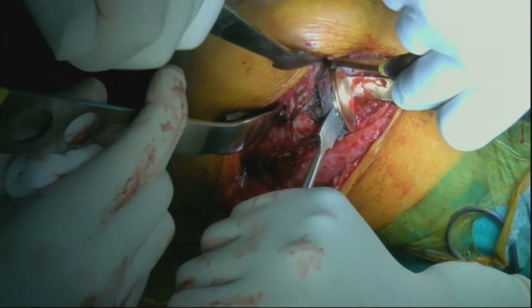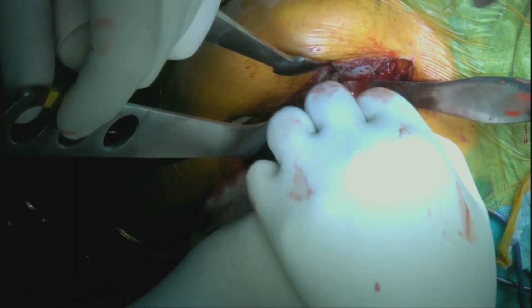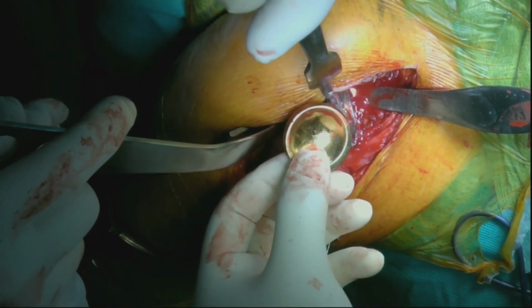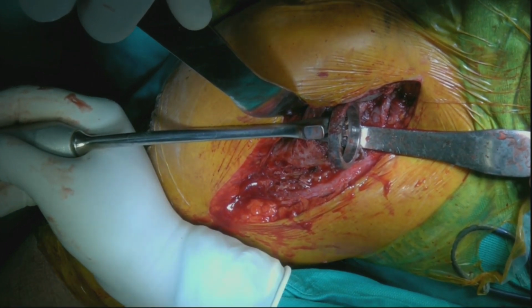And I have different videos of the surgery. So the first step is to remove the stem. Until here, I'm so lucky, very happy at this point. Very easy. And then here begins the bad day.